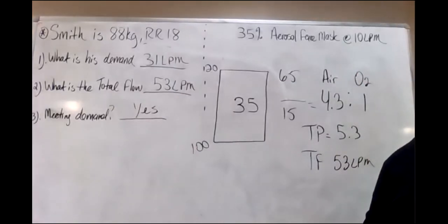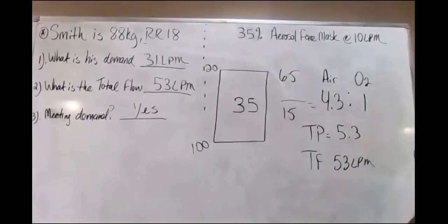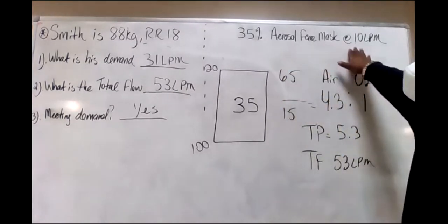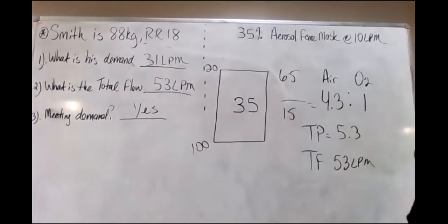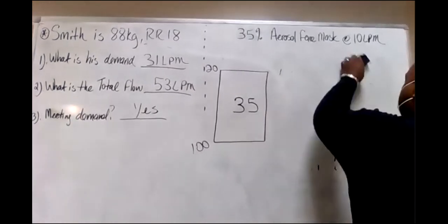There you go. All right, one more, and then we're going on to the actual devices so I can show you how they are, what they look like, what I'm talking about. This right here is a high-flow device. I'm gonna show you how it's made, okay? All right, good job. Let's do another.